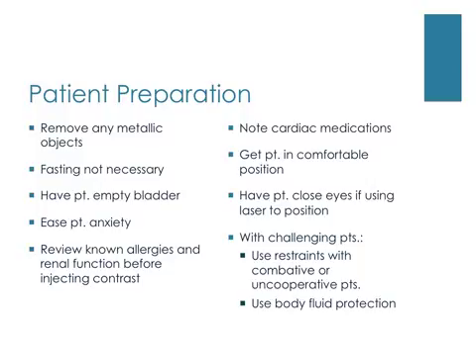They can be moved out of the scan even after the topogram is done without having to redo the topographic image. So basically what that means is that if you do a scout or topogram, then you see that the patient has maybe some hairpins in or hearing aids right in the area of anatomy that is being imaged, then you can actually have the patient remove those objects without having to start over and redo the topogram.